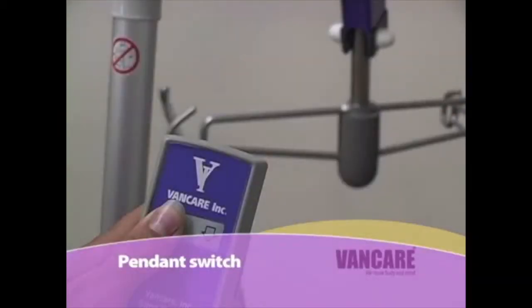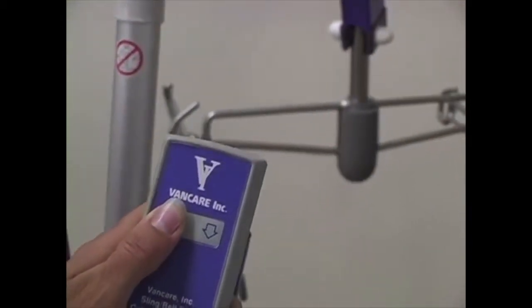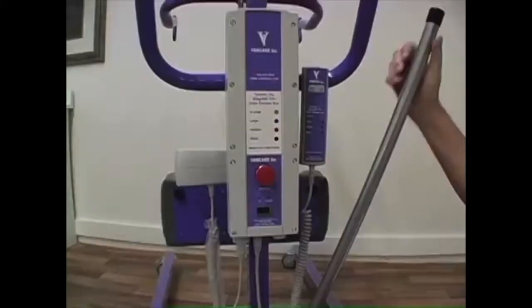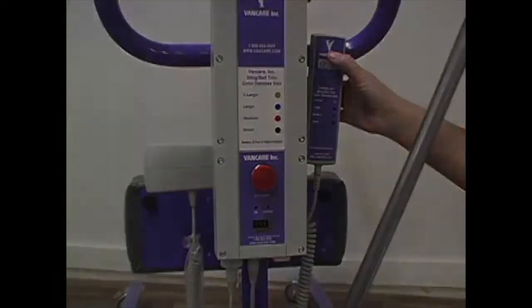The pendant switch. The pendant switch is used to raise and lower the lift. To raise the Vera 2, press on the up arrow. To lower the lift, press on the down arrow. The pendant switch attaches to the lift with a clip or magnetic base, allowing for multiple attachment points on the lift during operation.